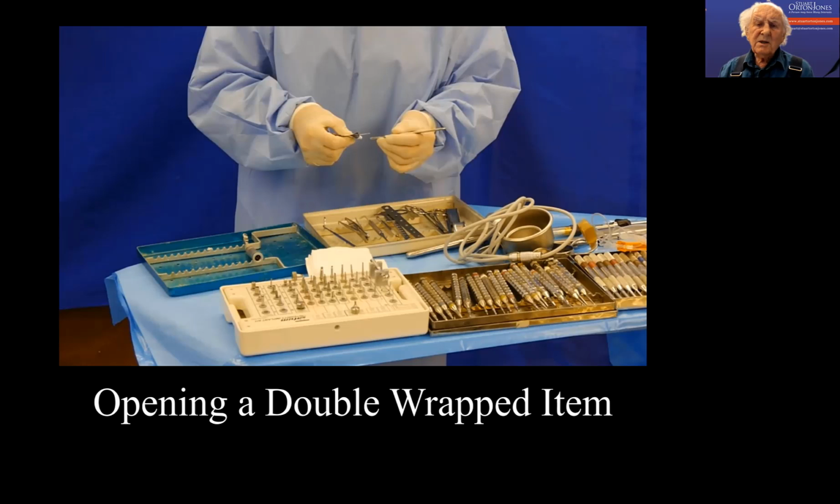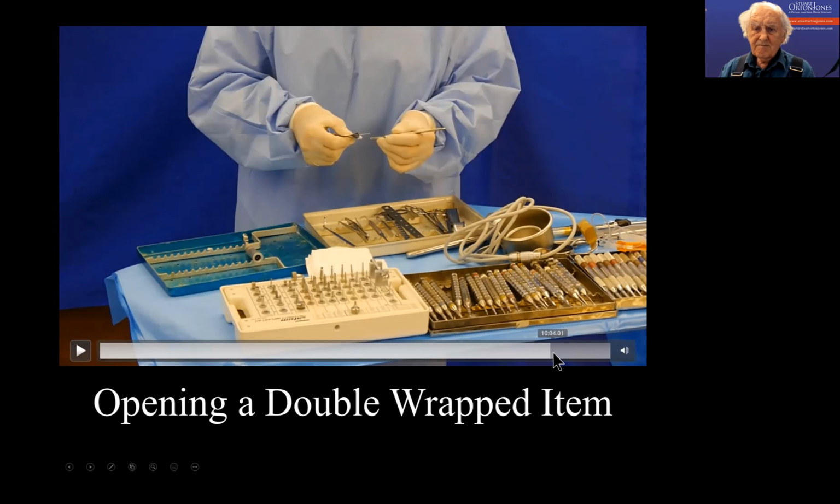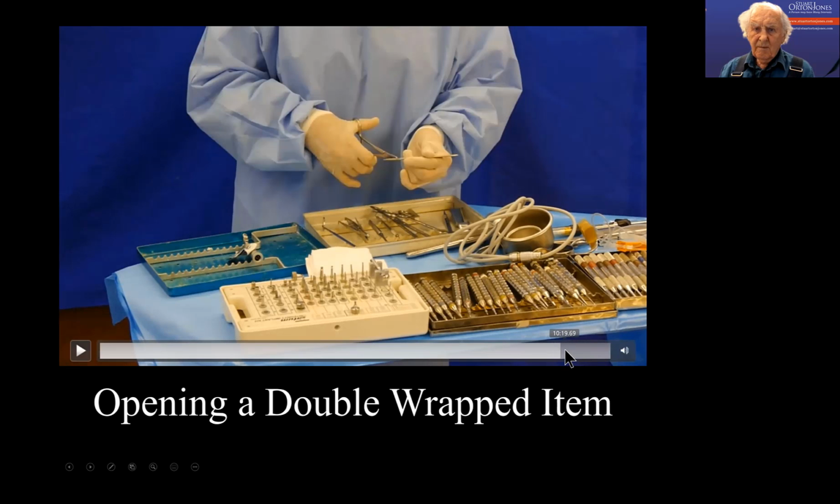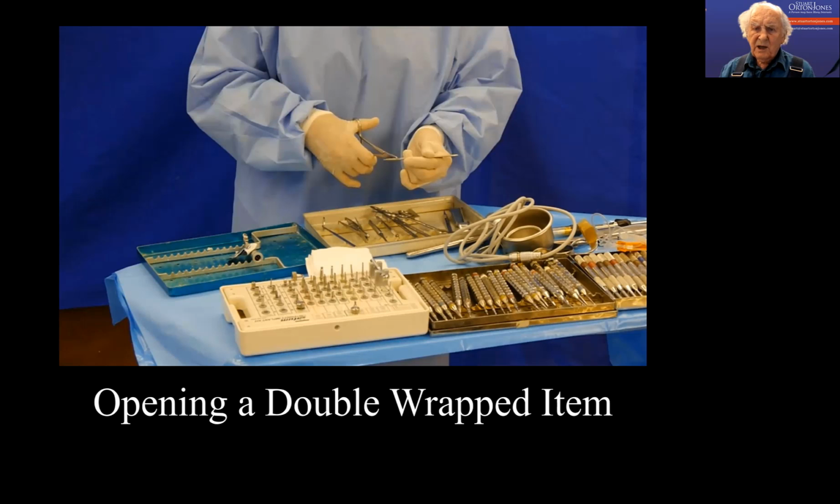Whereas in my situation, the instruments and the blade in its packet are sterilized at the same time. So she's now pushing the blade onto the handle.